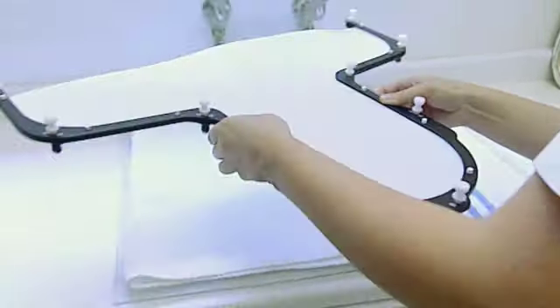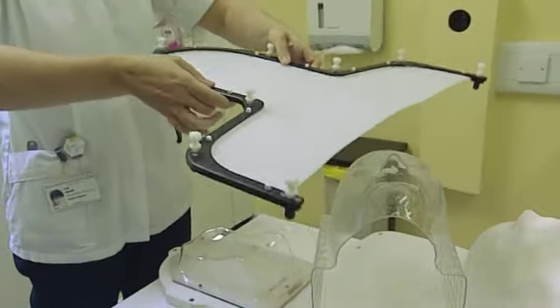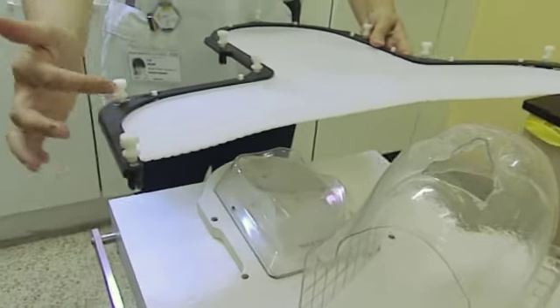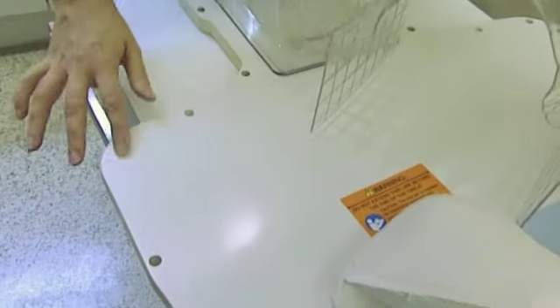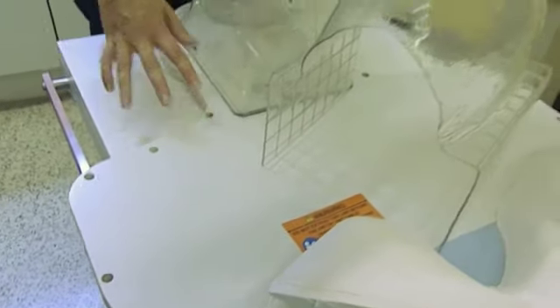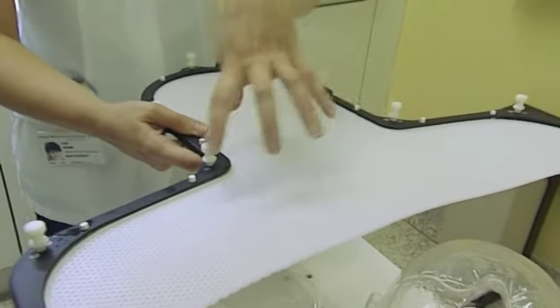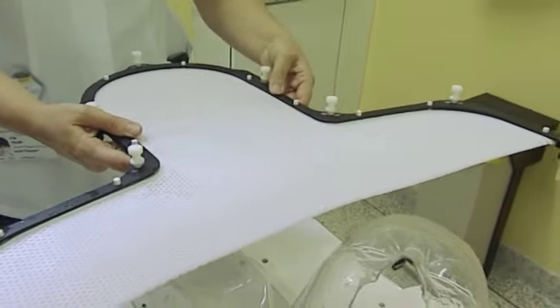We then bring the Orfit over to the patient, rest it over their chest area, and then pull it down over their facial features. We then locate these poppers into the location holes here on the board. I then rest my hands around their eyes and nose area, and any treatment areas around the neck, to form the mask.